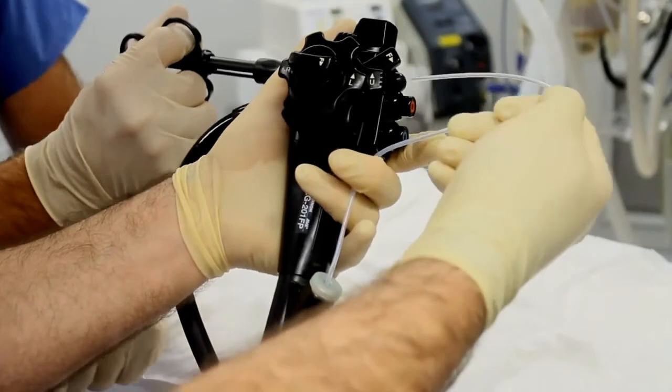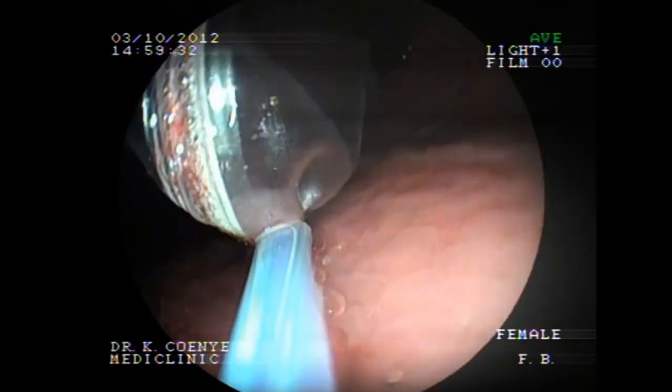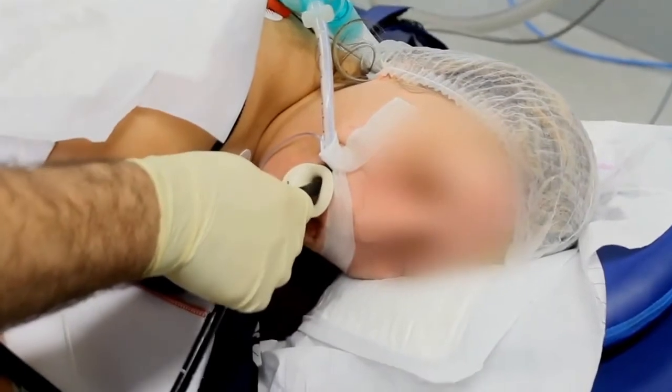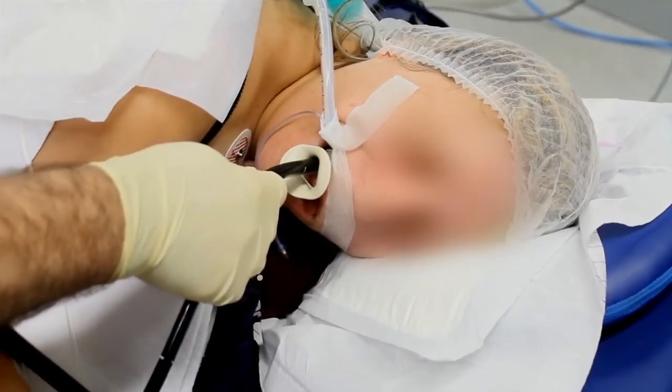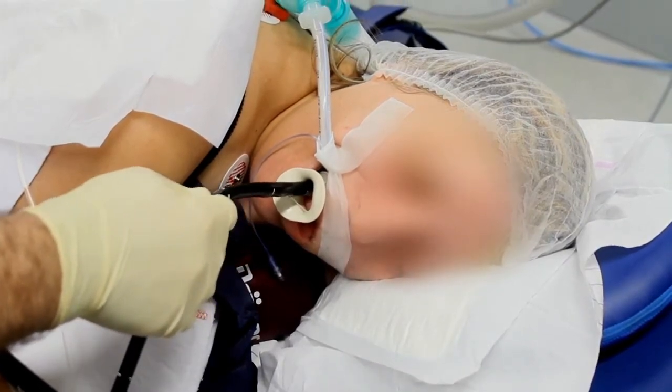Hold the extraction forceps firmly to obtain a solid forceps endoscope assembly. This step is important as it allows you to pull on only the endoscope during the extraction. Pull at a moderate, constant speed. Do not release the forceps endoscope assembly until the balloon passes through the cardia orifice.